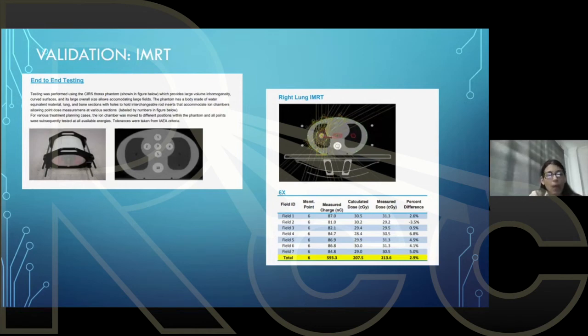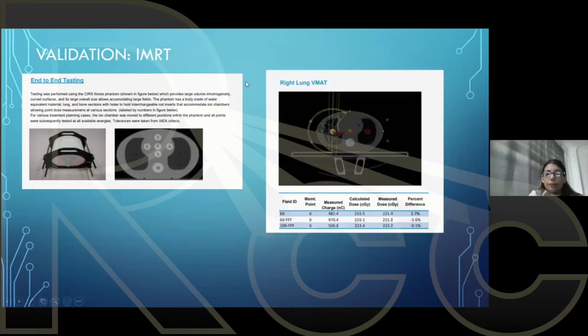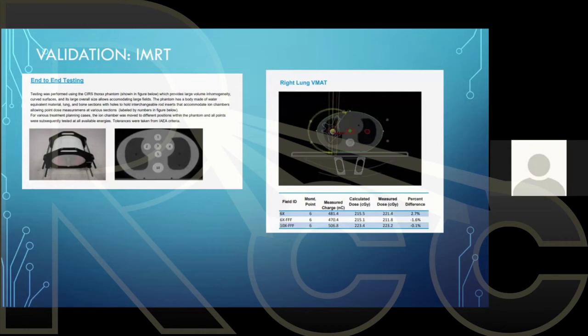You have to acquire a lot of measurements. Paulina: Yeah, here, should we rely on our treatment planning system or the detector we have measured? Speaker: The tweaking of the value is a bit tricky. Yes, the measurement is a good start for you. You put your measurement there, and then you calculate a simple plan.